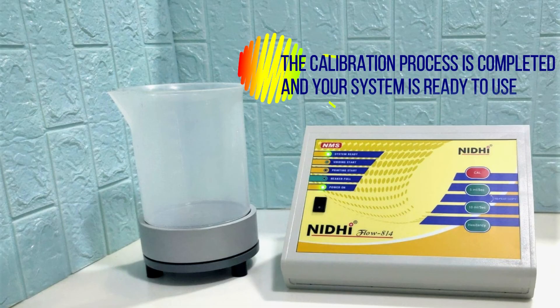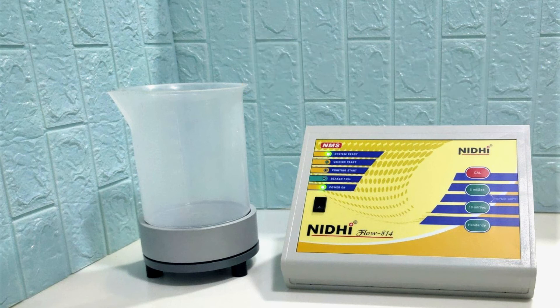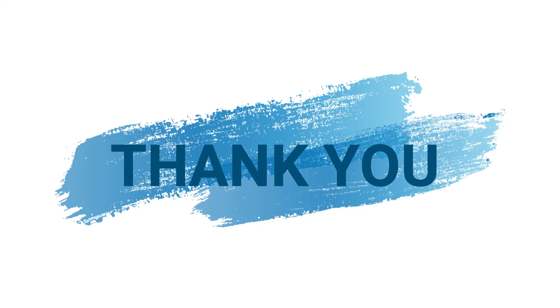The calibration process is completed and your system is ready to use. Thank you so much for watching.